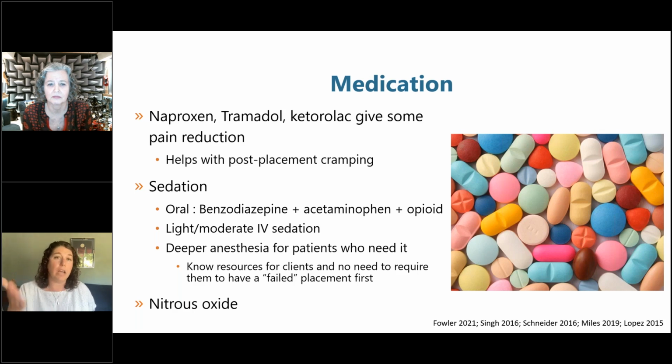I would say, "I hear that you want some numbing medicine. I personally am not able to provide the numbing medicine that goes fully in your cervix, but we do have an option for this other medication that could help reduce the pain." Then it's up to the client to decide whether that's an acceptable pain management strategy for them. That was coming up in the chat about what to do if you can't do one of the things.